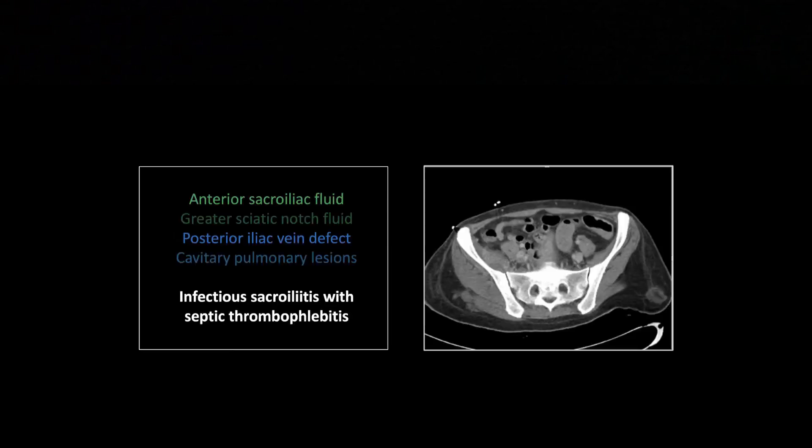This is one of my favorite cases. Going down into the pelvis: there is a fluid collection sitting right there deep to the iliacus muscle, on the anterior aspect of the sacroiliac joint, just anterior to it and extending out laterally, creeping along on the deep aspect of the iliacus right against the ilium. That is the classic location for fluid collections to decompress when originating from the sacroiliac joint.